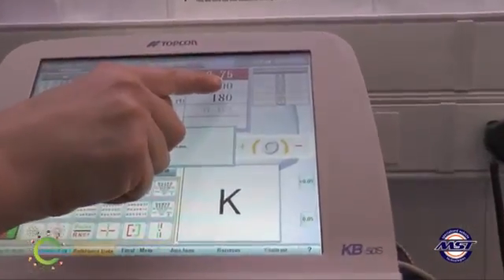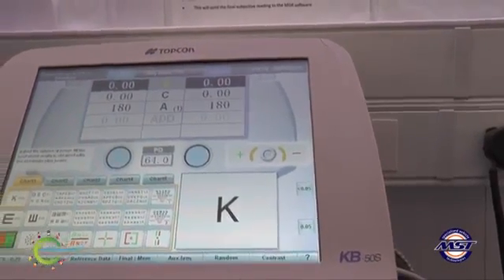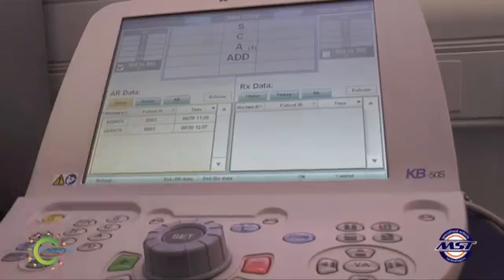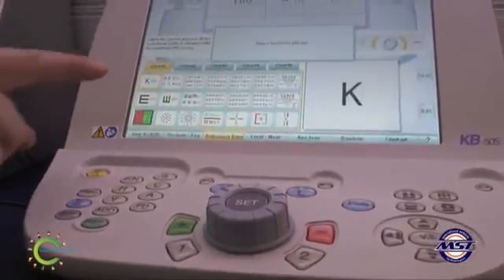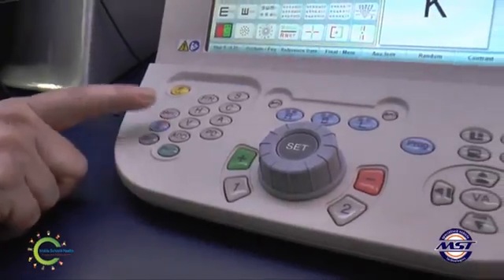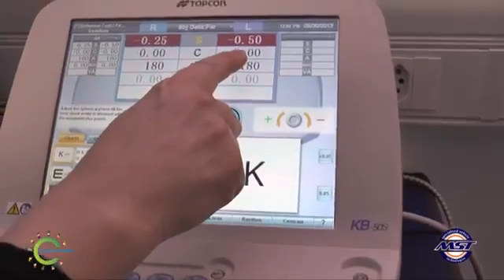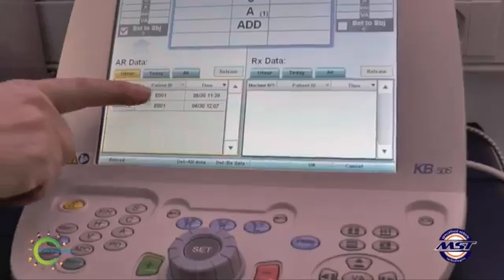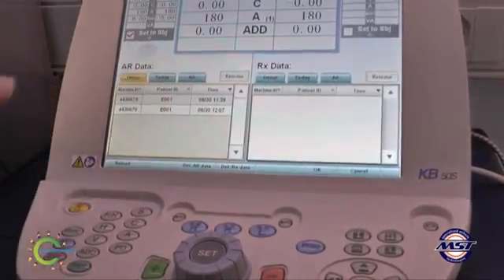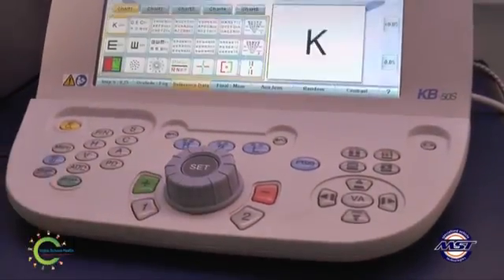Now, from the TopCon keypad, we can import the autorefractor reading from the digital phoropter. It is important to first clear all the existing lenses in the phoropter. Pressing the In button, the information from the autorefractor will be updated under the unique patient ID code. Select your patient ID code and press Set, which will automatically place the autorefractor readings in the phoropter head.